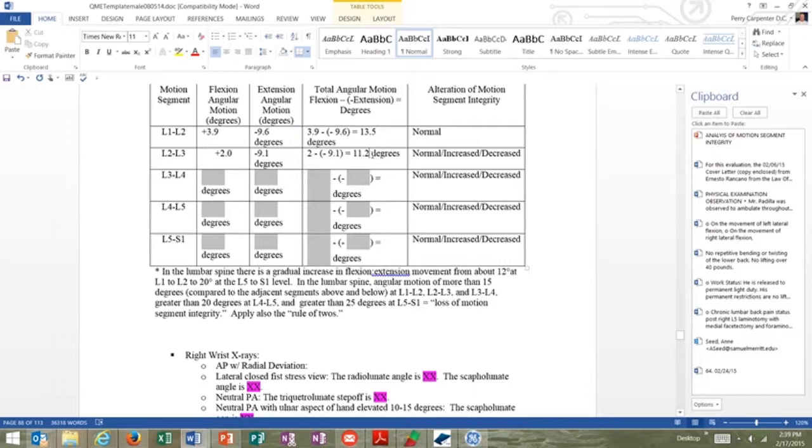So here we should be somewhere between 12 and 14 degrees, and we're at 11.2. And so with our margins of error and crude measuring, I'm just going to go out on a limb, and I'm going to say that that's sort of roughly within what I would consider to be normal limits. If it's not normal, it's certainly not terribly abnormal.